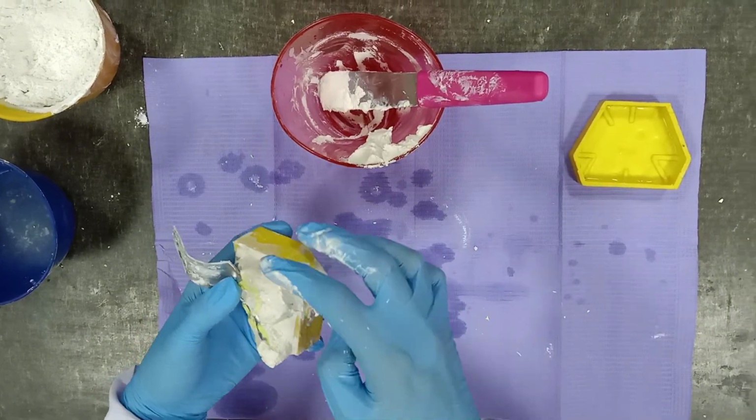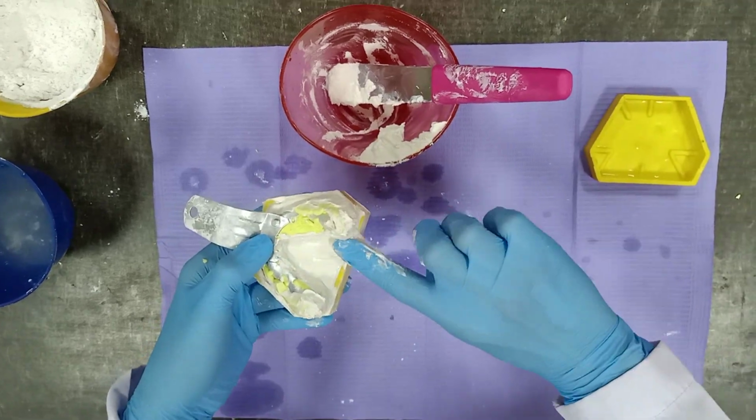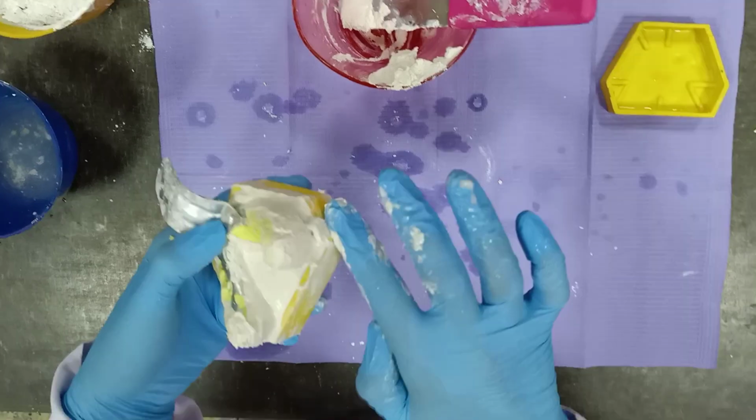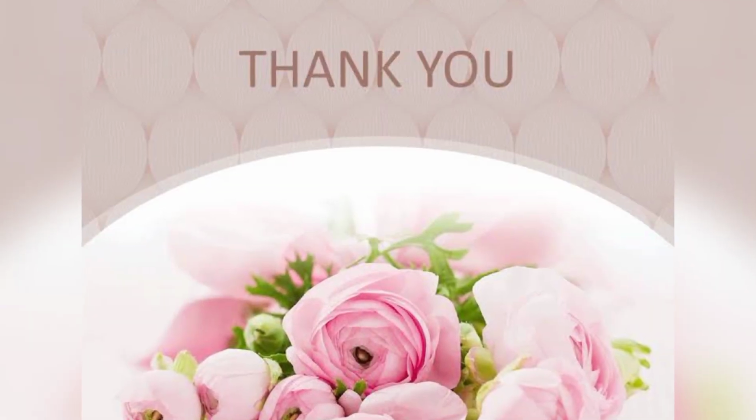And the advantage of the base former is that you don't need trimming after you remove the cast from the base former, and now you have your study cast ready for the next step.